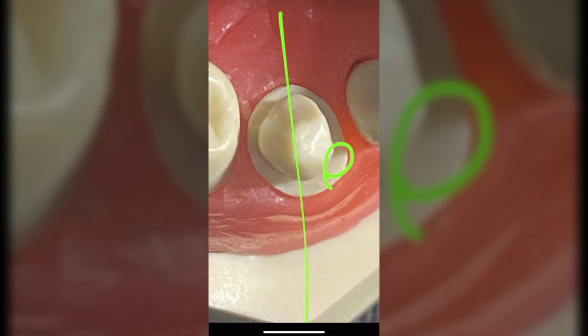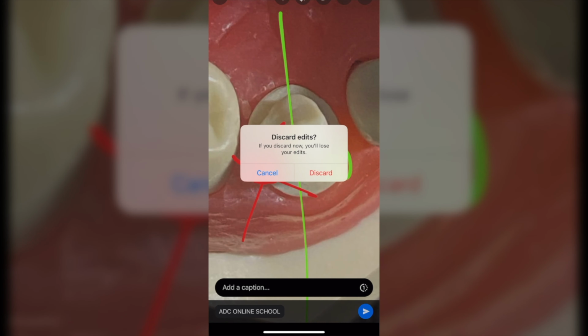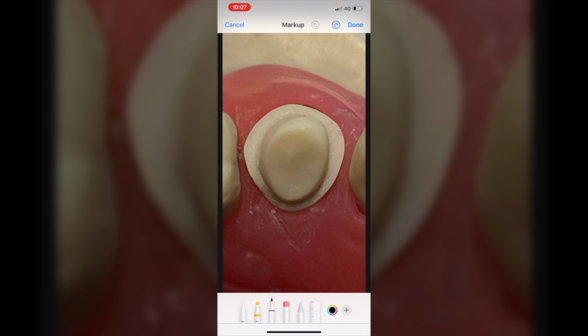Look at the margin here. Look at the margin here. Can you guarantee me that you have a 1.2 here? How about here? Do you think it's 1.2? Because I'm going to fail you here right away. So again, you're reliant too much on the putty. Notice here, not a bad attempt, but again, we have fallen into the trap of assessing too much with the putty. That's what I see.